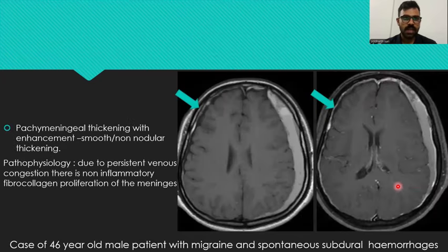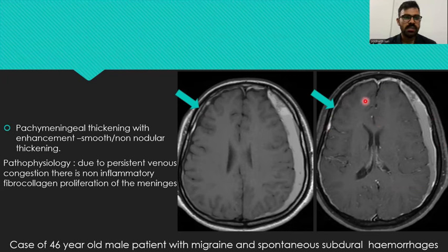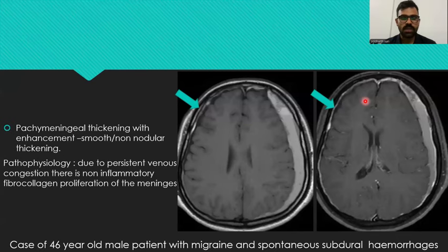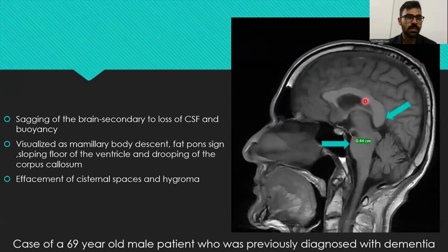Pachymeningeal thickening with enhancement, which could be smooth or non-nodular as depicted here. The pathophysiology is due to persistent venous congestion, resulting in non-inflammatory fibrocollagen proliferation of the meninges. This is shown in a case of a 46-year-old male patient with migraine and spontaneous bilateral subdural hemorrhages.